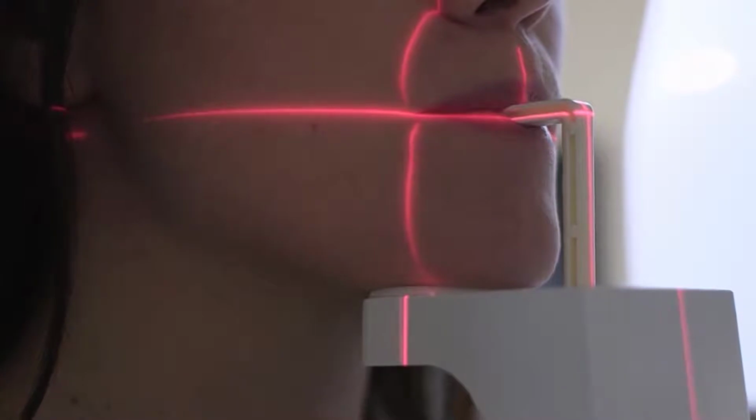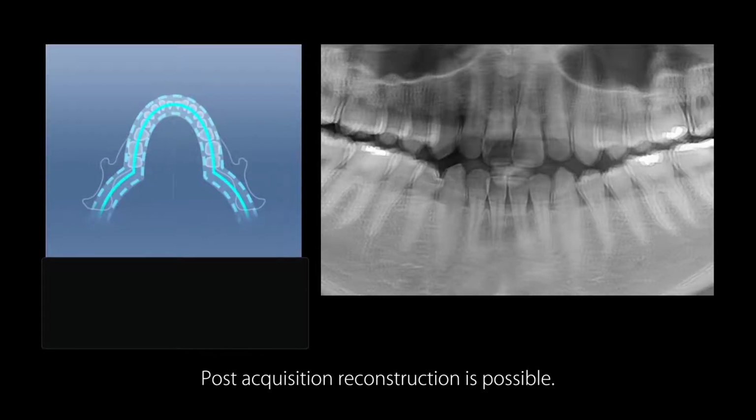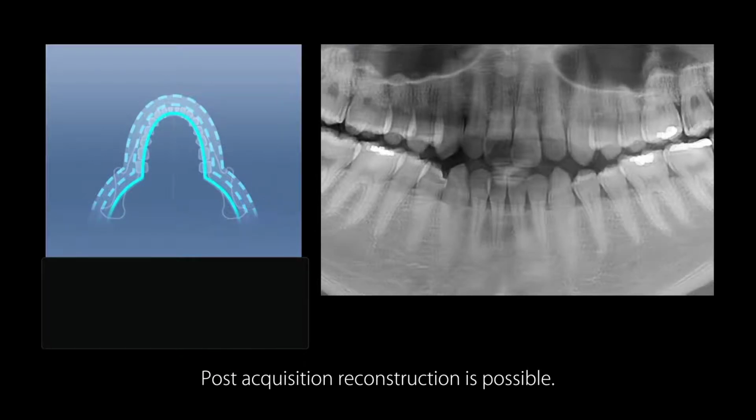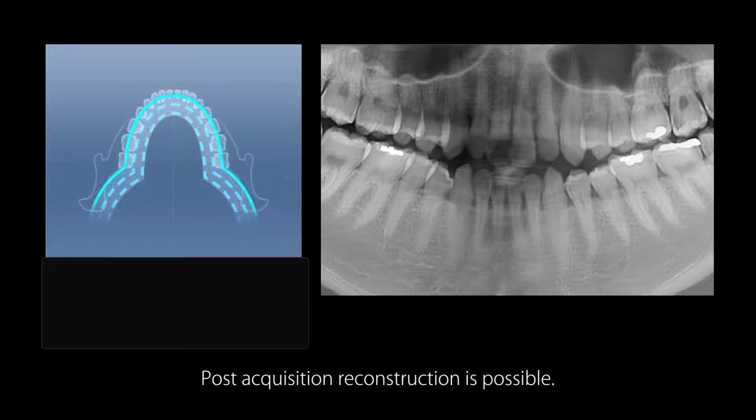Because every patient is different, sometimes there are specific areas of the anatomy that you would like to further optimize for. The secret is that all of these focal planes are at your fingertips, and you can use them to dig deeper if you would like.